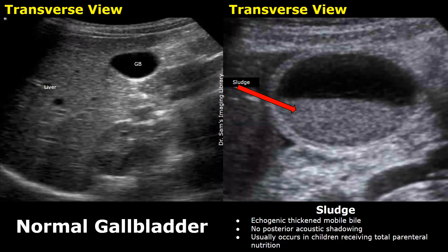This is a transverse view showing gallbladder sludge. We can see echogenic thickened bile with no posterior shadowing.